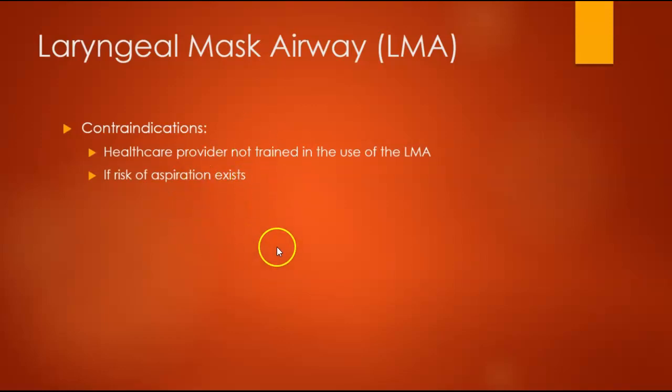These, because of where they sit in the airway, do increase your risk for aspiration. They sit supraglottically, meaning I'm not sealing off my airway, I'm just kind of resting above it. So if my patient does vomit, I do have a risk that some of that will end up in the trachea, which, when you get to respiratory disease and learn about aspiration pneumonias, you know are pretty wicked, nasty versions of pneumonia with high mortality rates, so we want to avoid that whenever possible.